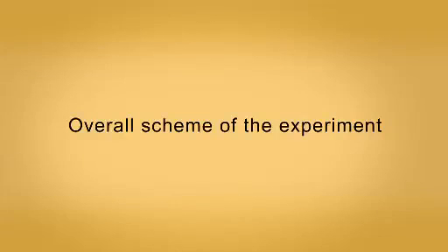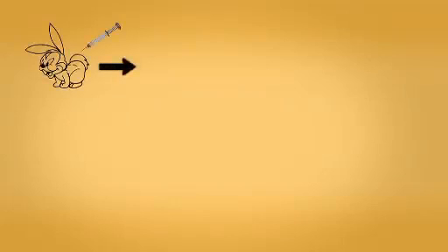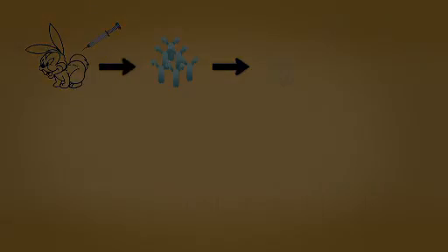When establishing the passive transfer model for EBA, a few additional steps must be performed prior to autoantibody injection into wild-type mice. As a first step, white rabbits are immunized subcutaneously with the purified recombinant antigen. Total IgG from rabbit serum is isolated by affinity column chromatography and subsequently injected into wild-type mice.